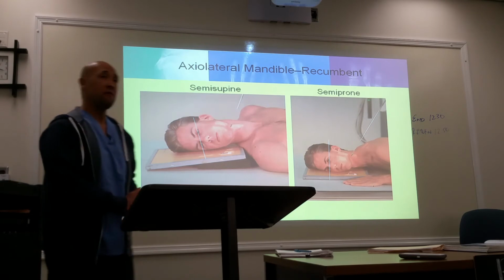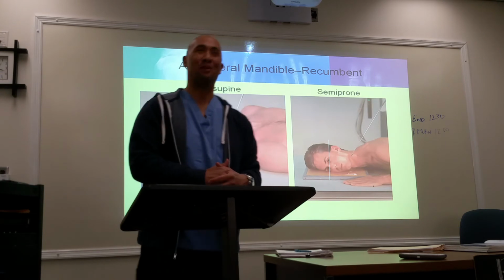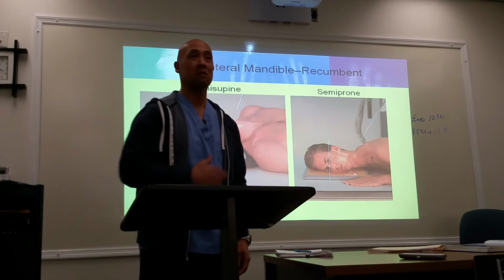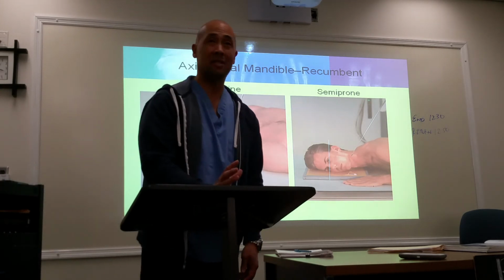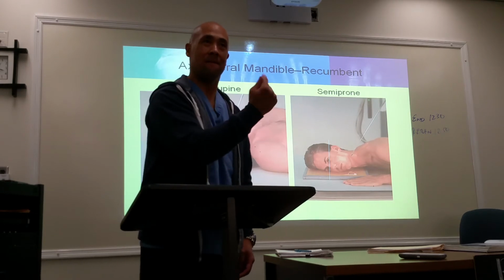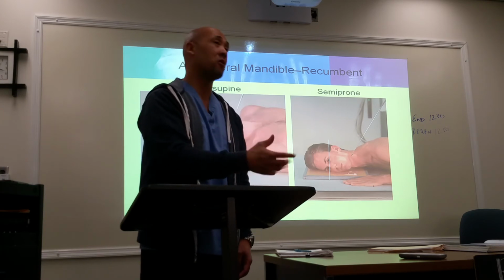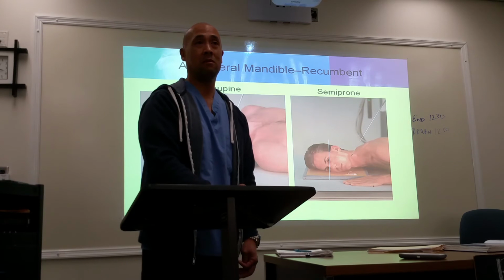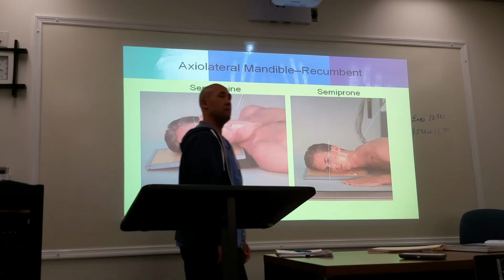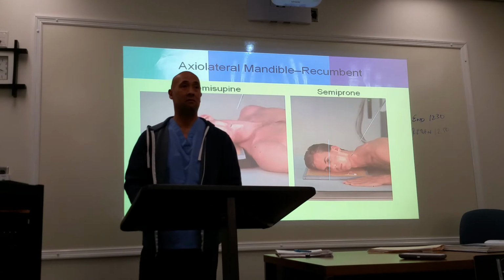Now, when you go out in the field and you're doing a mandible, the technologist or your supervisors could say, just do an oblique. They really don't have a standard. But for test purposes, remember the 25. Remember the 30 rotation. Remember the 45 rotation. Because in the field, they just say, just oblique it, and you're done. But the degree of rotation and tilt are going to show different things.